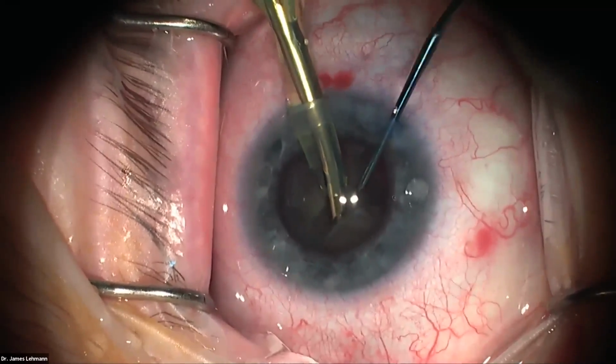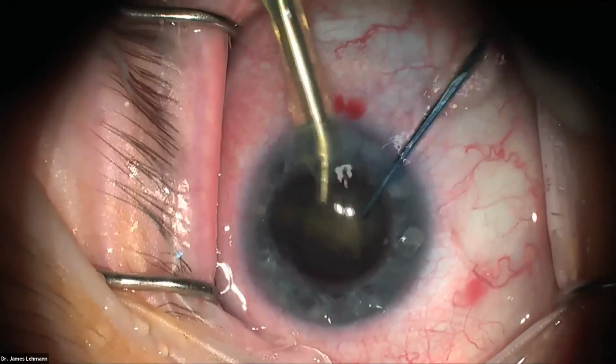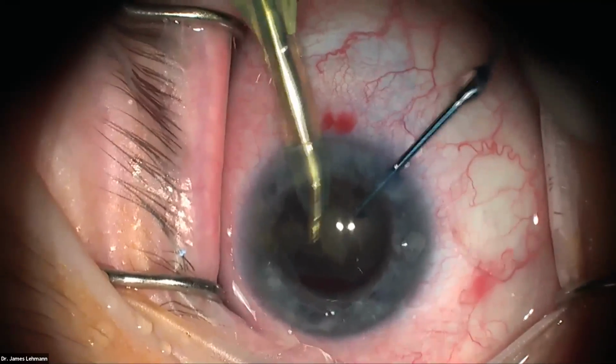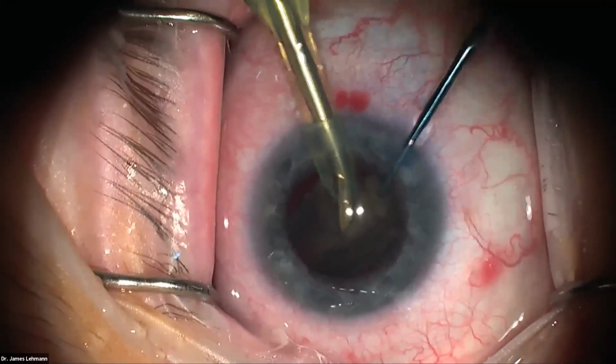Now we're going to go get this quadrant. Again, I kind of lift it up, rotate it out, trying to eat it in the iris plane, maybe a little higher. You can tell in the center it's attached to the other part. You can see a little denser here in the center, that white area there. And you can see now the lens is kind of freely mobile.